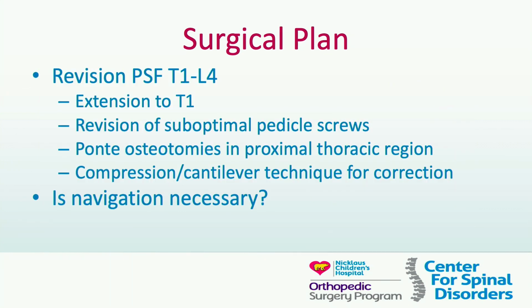Again, you'd like to do as little as possible. You'd like to say, well, let's extend this up maybe just one level to help correct this. But then we also know that we've got these malpositioned screws up at the top as well. And what's the reliability in being able to recannulate those pedicles at the top and be able to get enough purchase there to actually improve that deformity with such a small area? Is navigation necessary here? I don't know.